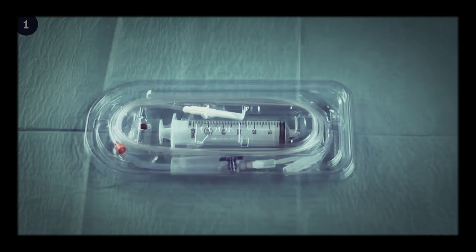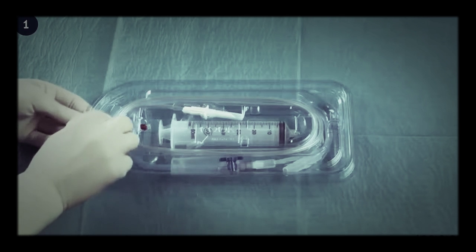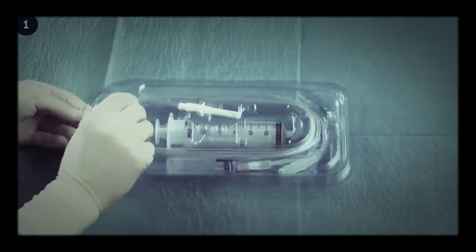The Bakri balloon is used for the treatment of postpartum haemorrhage caused by uterine atony when uterotonic drugs are unavailable or ineffective.